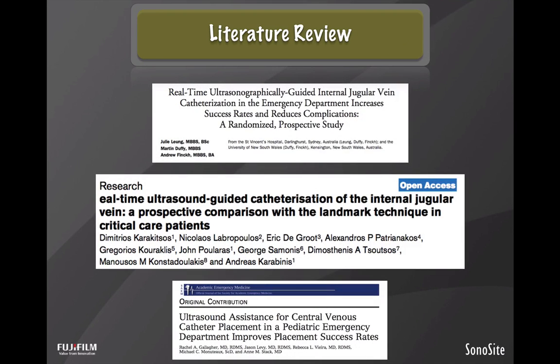So let's talk about the literature really quickly, because I think it's somewhat irrelevant when it comes to procedural guidance. I can show you that in emergency medicine, in critical care medicine, and in pediatrics, in the hands of very experienced providers, their success rate is actually very high, and their adverse event rate or complication rate is very low. The hard part is how to extrapolate that data to you or to somebody who is more novice in this field.